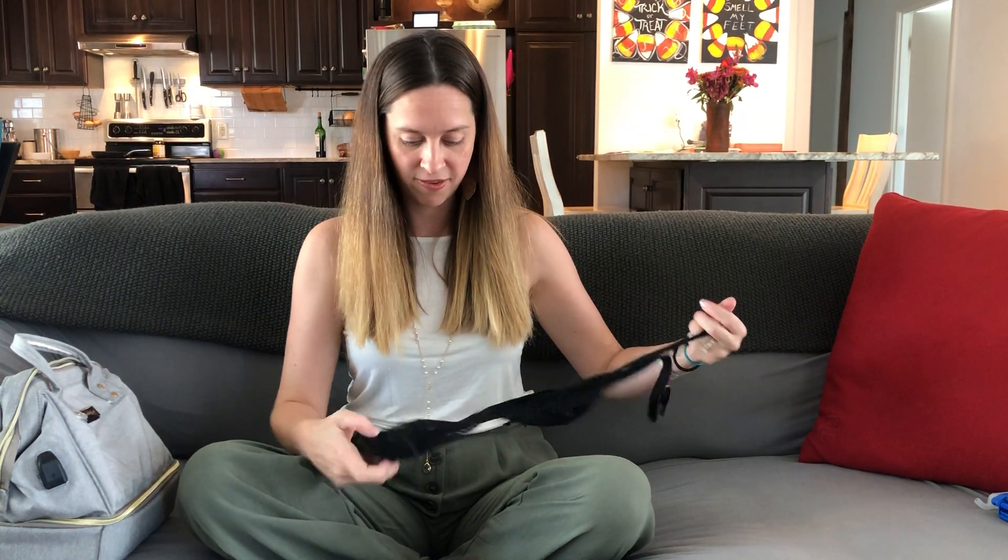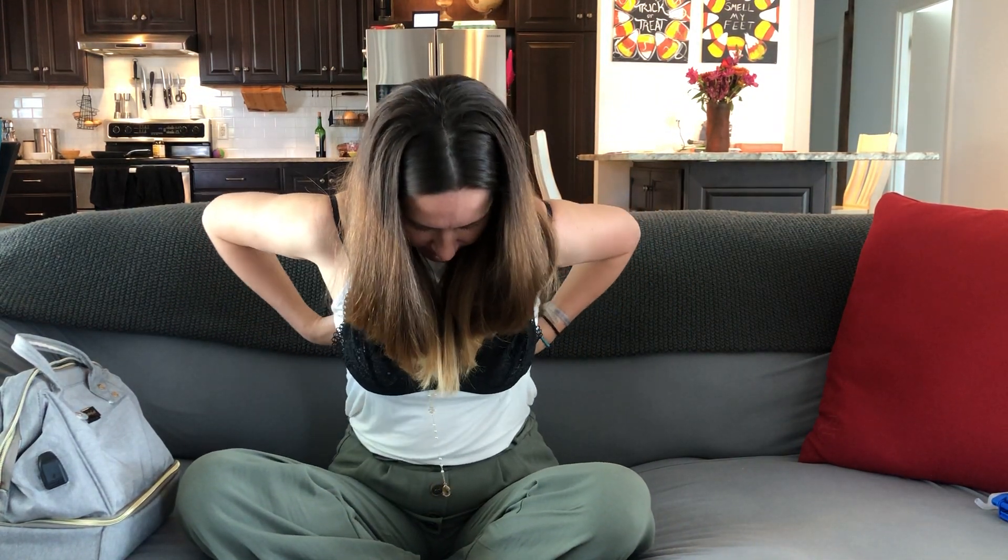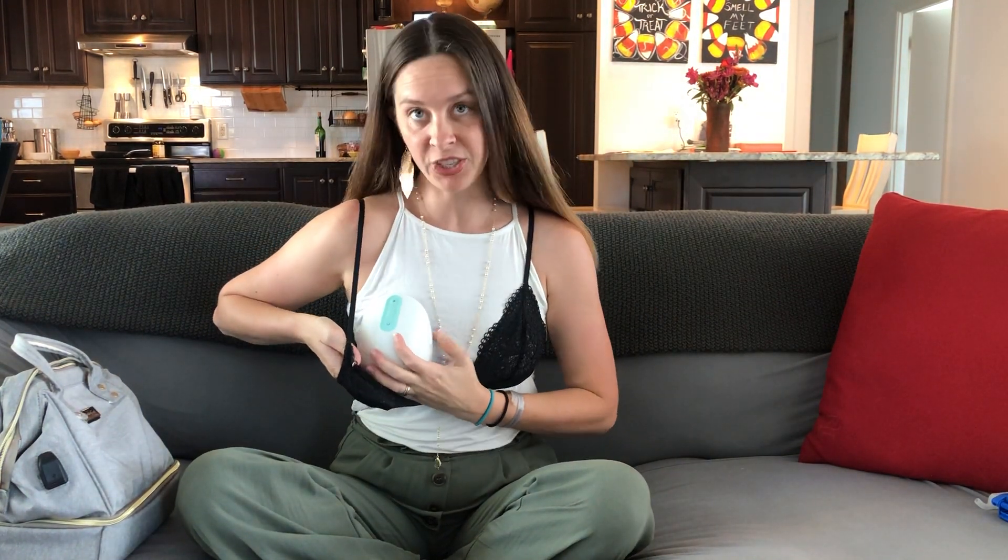I'm going to show you real quick how it gets put on — I'll grab a bralette. Any tank top, bralette, whatever — you're going to take it here, center it, and then it will latch and hold in place like this. Put a t-shirt or tank top on over it, do your dishes, kitchen cleaning, cook dinner, take care of the babies, drive — all that kind of stuff. That's how it sits in your bra or tank top.